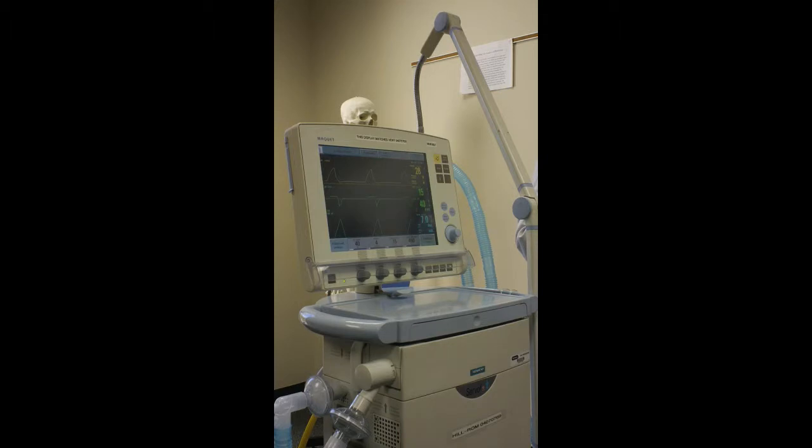Okay, TINSP, inspiratory time. Sometimes you'll see it as I time. Sometimes you'll see it in seconds. Sometimes you'll see it in percentages. But that's where you'll put your set I time.